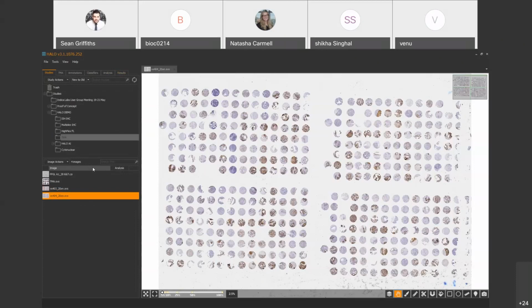Okay, I hope you all had a play with Halo based on the conversations we had a couple of weeks ago. This time I'm going to cover a few of the topics under the title Intermediate Training. This training will assume that you've already got a little bit of a basic understanding of the software. It's okay if you don't, because all of the training that we offer at Indica is unlimited, so we can always come back and revisit. This can be done individually or en masse, as you prefer.